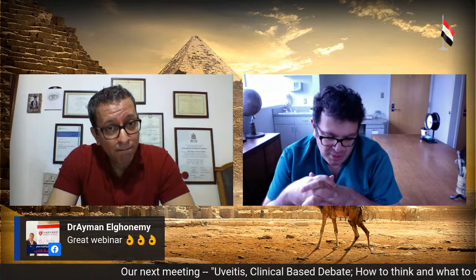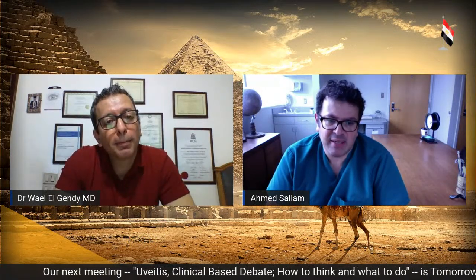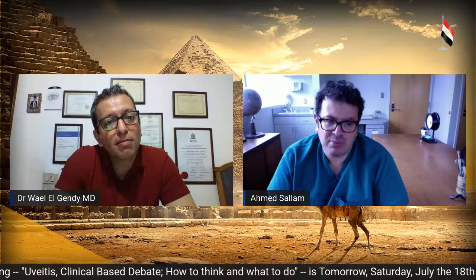The main problem I have is more from a cost point of view. I use PFCL, and if the retina slips, then you need to use another vial of PFCL. That's $700. So now I've wasted $1,500, which is actually all that we're paid for in terms of consumables, on PFCL, let alone the cost of other consumables. So it's really a cost thing.